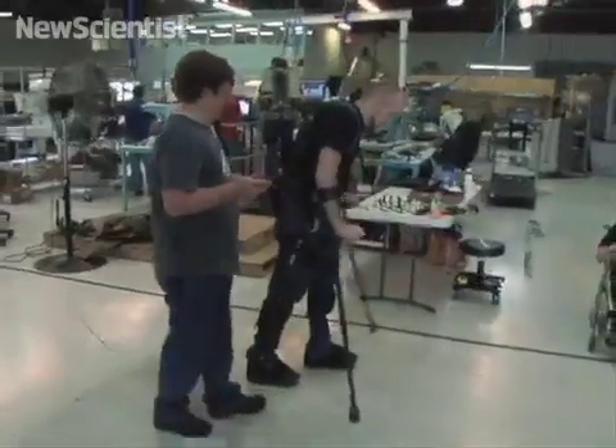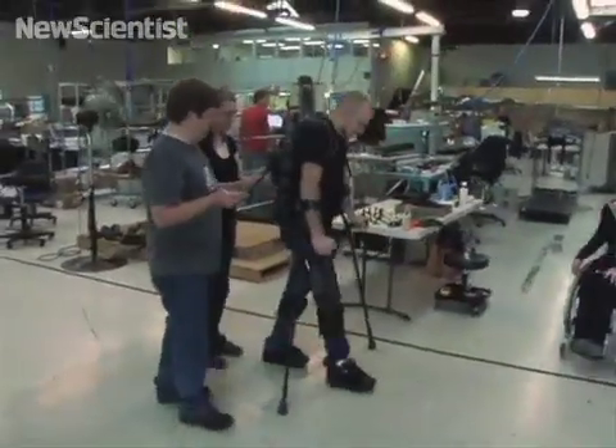Our focus right now with the product E-Legs is to take that device into rehab facilities around the country and allow people to retrain their gait, and to allow them to get up and exercise their bodies in ways that they have not been able to do with traditional rehab facility equipment.